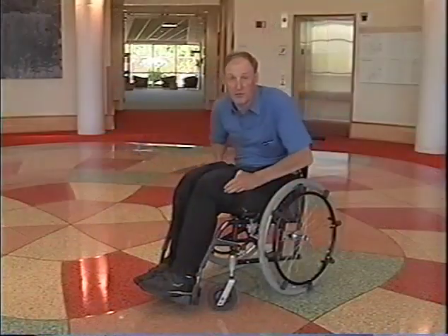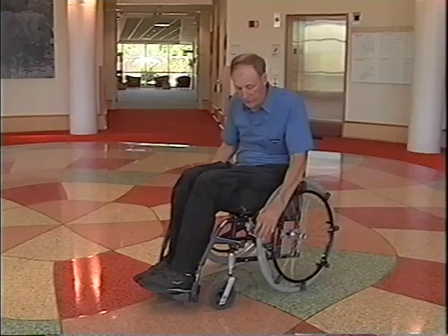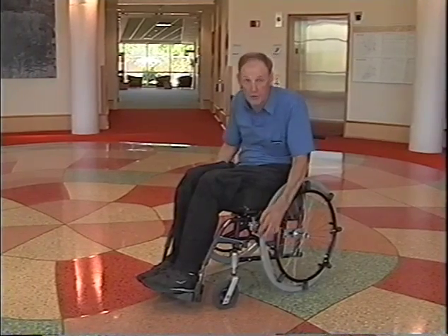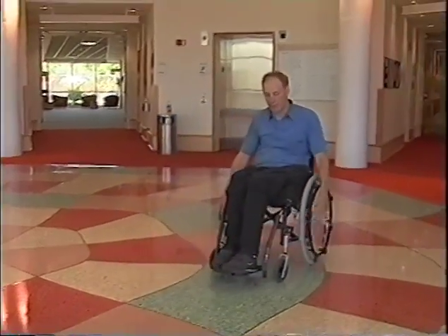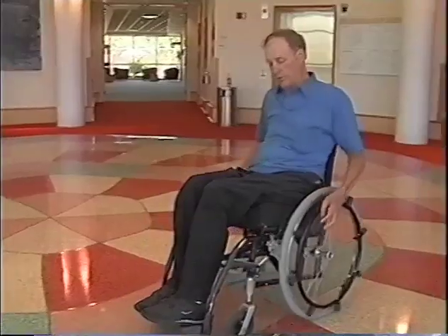When you have projections and you need to back up, backing up can be very frustrating. There are 2 things to do. One is to put your body forward and try to catch the projections with your wrist, and then throwing your weight backwards and pulling backwards with your hands. So, not too easy to do. And the other way, just putting your body into it, is one way.